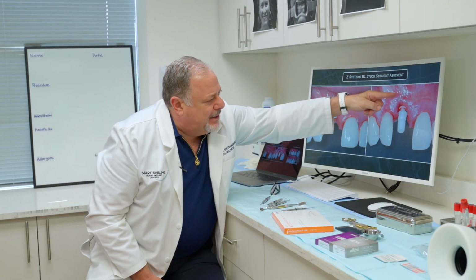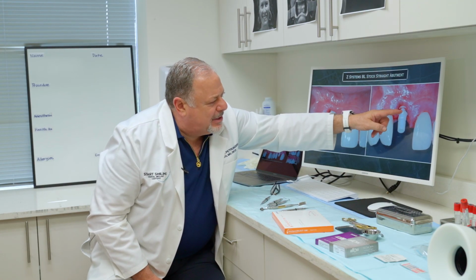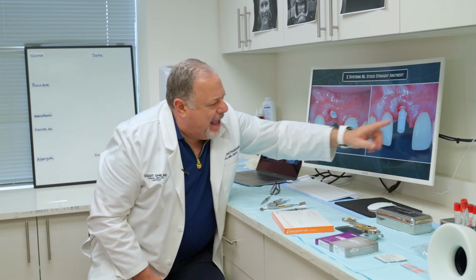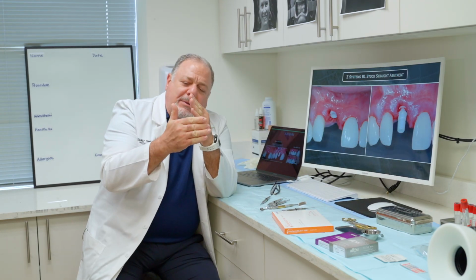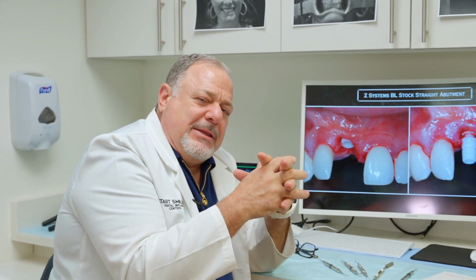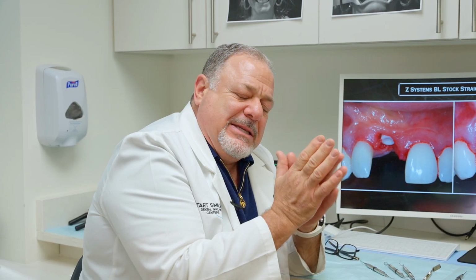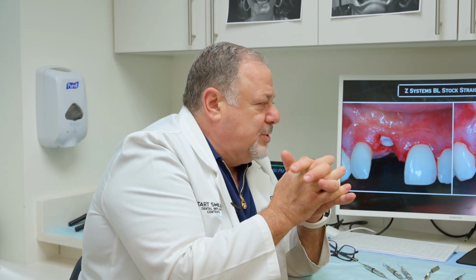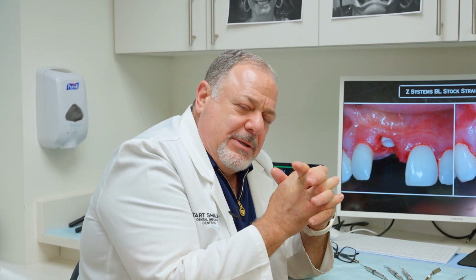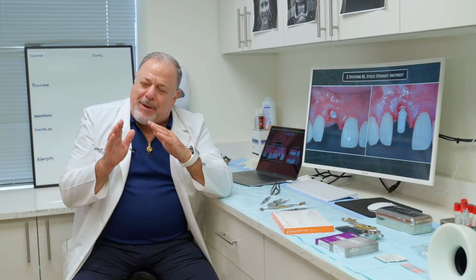So my goal, when I bring this tissue down, is to get the bone level to here, and then the tissue to form a seal around this little gap. Once that seal is formed, the micro gap we have to worry about with a titanium abutment and a titanium implant is basically a non-existent issue with what we're seeing with zirconia implants and zirconia abutments. Another big check mark taken out of the box that we really have to focus on with these things. So this is what they're doing, they're changing how we're really practicing some of this stuff.